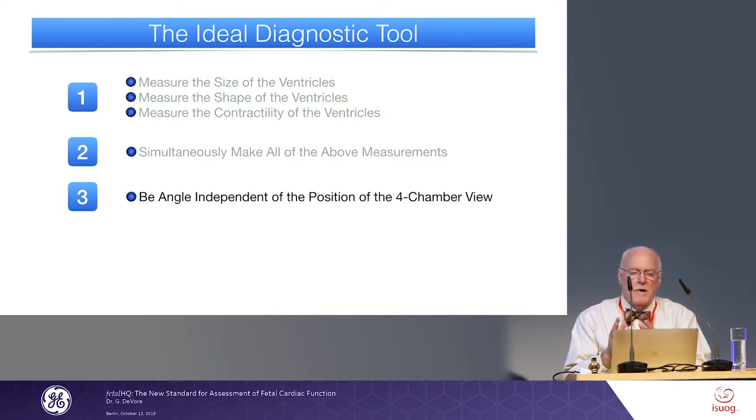Thirdly, I'd like it to be angle independent of the position of the four-chamber view. Many of you may know that all the Doppler studies of looking at cardiac function, or the TAPSE or the MAPSE, unless you have an M-mode that you can steer, all of them require the four-chamber view to have the apex at 12 o'clock or 6 o'clock. The trouble is, in the third trimester, that position we saw only 25% of the time. I don't have time to spend an hour bouncing that fetus around in utero, having the mother walk, come back. I don't have the time. So I found that tool not as helpful because I couldn't get the position apex up all the time. So that's why it has to be angle independent.